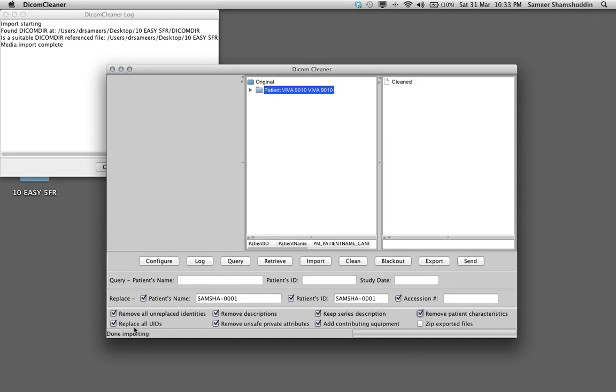Check this box remove patient characteristics, replace all UIDs. This is the advantage of DICOM Cleaner. If you check this box all uncertain UIDs like some patients, some hospitals put in hospital ID or something, some machines put in different UIDs in different places within a DICOM data. So all this will get stripped off.